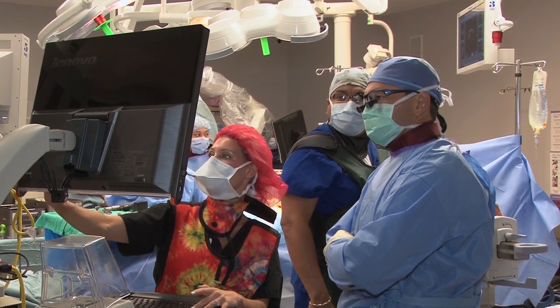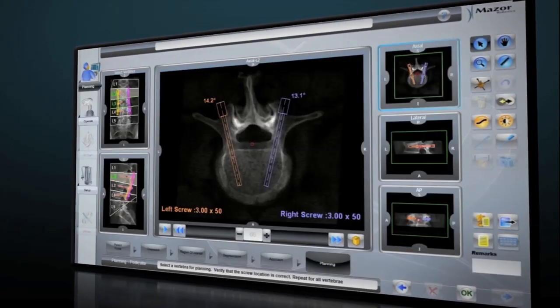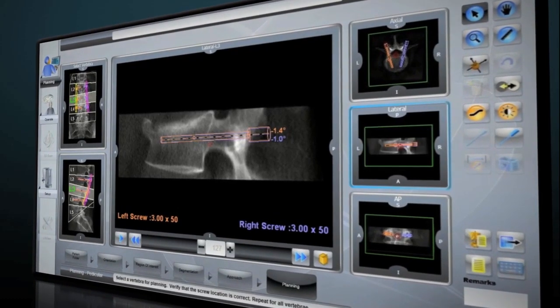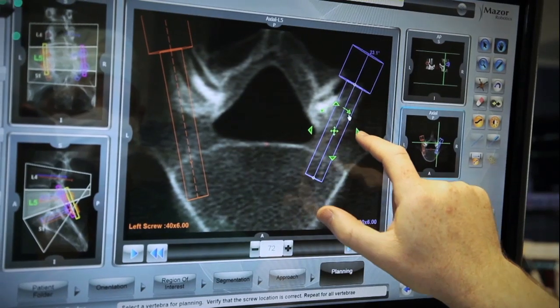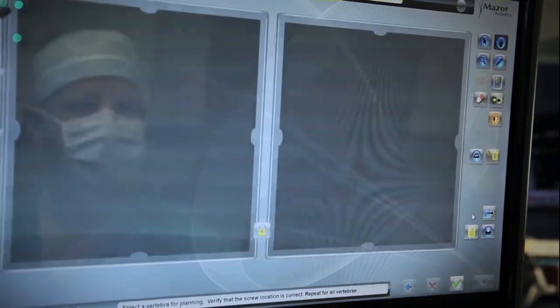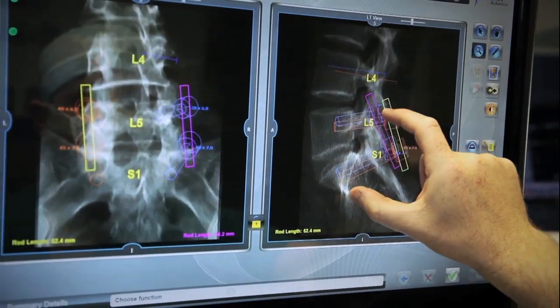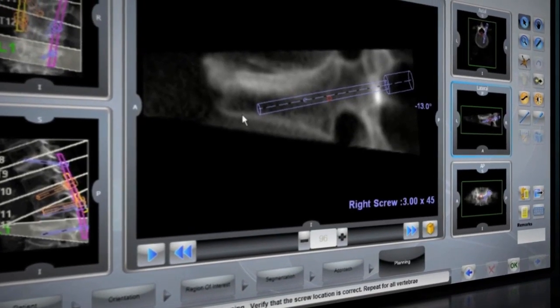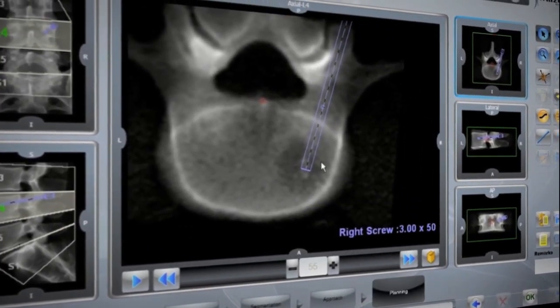Renaissance's interface allows the surgeon to review and modify the plan in axial, lateral, and AP views, until fully satisfied with the location and purchase of the implants. The preoperative surgical blueprint can be reviewed in a virtual video mode, displaying the anatomy slice by slice in all three surgical planes.